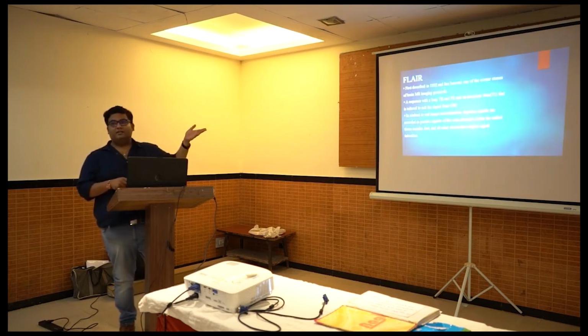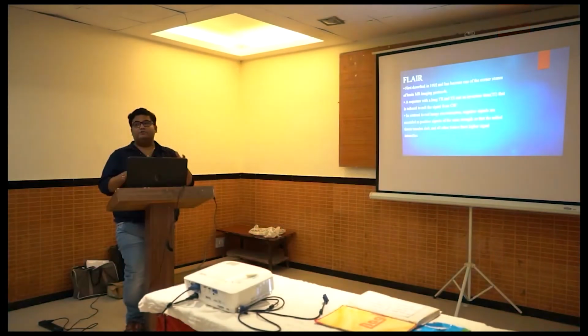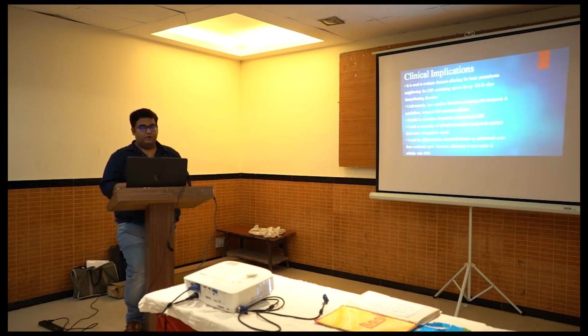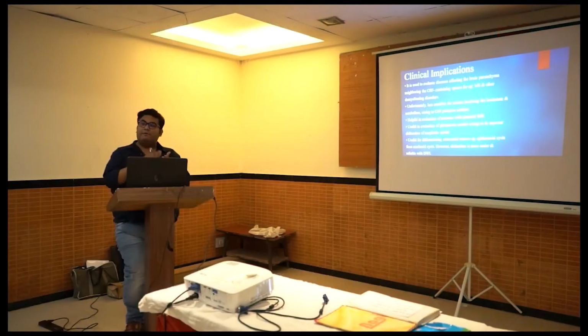So again we are talking about the FLAIR sequence, which is fluid attenuation inversion recovery. What happens here is we are suppressing the fluid. Here, sir, we are suppressing the fluid so that the pathology gets delineated separately. The FLAIR images are always there to confirm what we are seeing on T2, whether it is just a normal fluid or a pathologic fluid. If it is a pathologic fluid, it will be bright on FLAIR also.